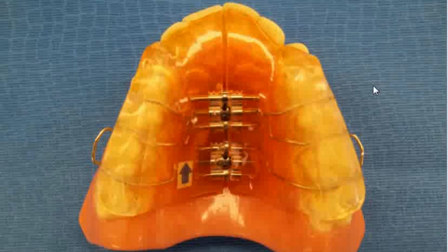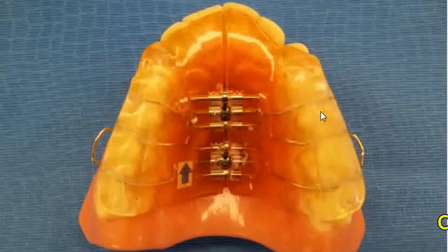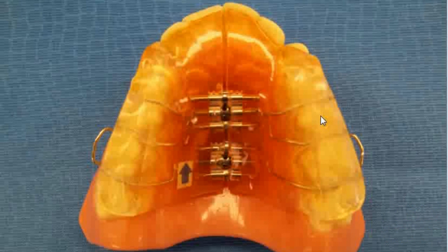If your patient has a posterior crossbite or you're concerned about opening the bite during treatment, posterior onlays can be added. In the case of a posterior crossbite, these onlays disclude the posterior teeth and allow them to expand without occlusal interference. The teeth slide over the lowers as the arch is expanded. If the patient has very little overbite to work with and you're concerned about the vertical, onlays can also help. The onlays prevent the teeth from tipping and help you control the vertical as the arch is expanded.